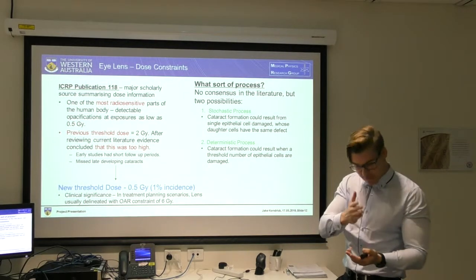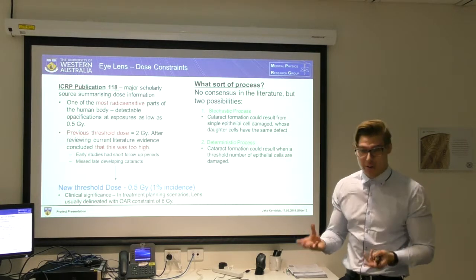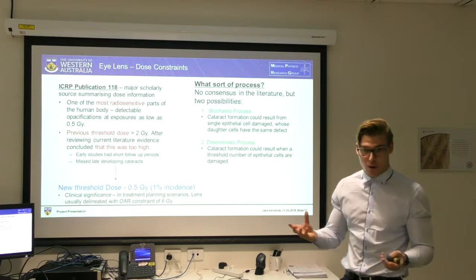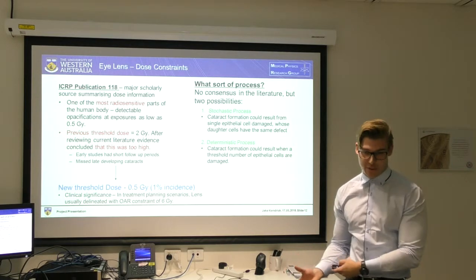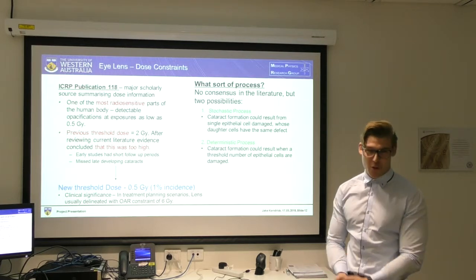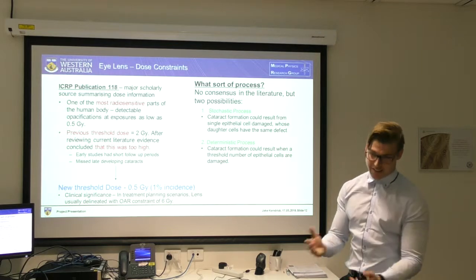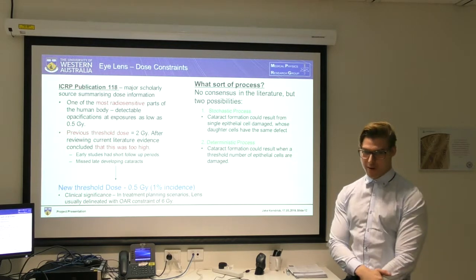We can organise the film arrangement to match up with that, and with the 3D dose reconstruction we can hopefully get the dose to the whole ocular region anyway, so we'll be able to calculate it for the lens. I'm not sure exactly what spacing there'll be in that structure at the moment. I haven't thought that far ahead, but that's the idea.